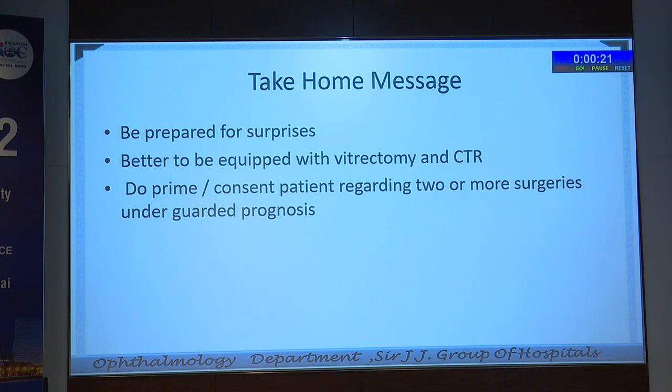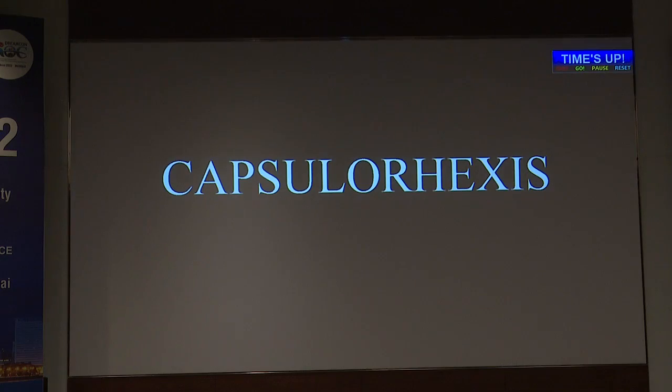Be prepared for the surprises, better to be equipped with the vitrectomy and CTR. Do proper consent. Whenever you are taking consent in such situations, when the patient is young and the father and mother are more anxious, that consent is very, very important. And if that consent is proper, then there is no problem. I think this video is not running. We will see if it runs.